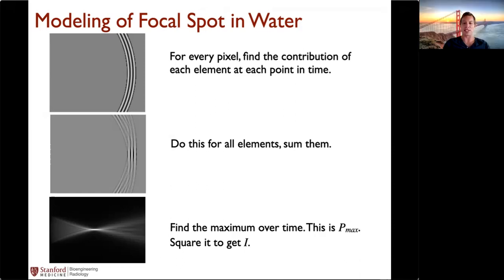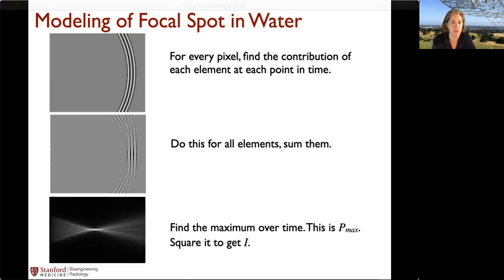So people would use these models before they've designed a transducer, and would they also use them once they have a transducer and a product built? So the thing is that once you have your transducer, sure, you can do this and say, this is what your beam looks like in a water bath. The thing that is now going to get really complicated is that if you're going to do transcranial ultrasound, the skull is going to aberrate the beam and it's not going to look like that. And then you have to do a much more complicated simulation.